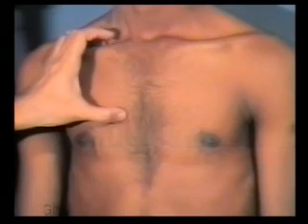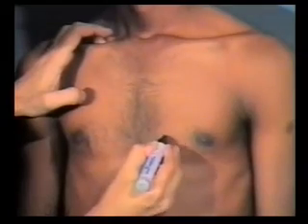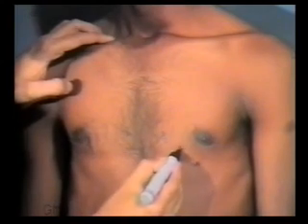The points are marked as follows. Palpate the sternal angle. The space just below the sternal angle is the second intercostal space. Mark the fourth intercostal space at right sternal border as V1. Then mark at the same level, that is in the fourth intercostal space at the left sternal border as V2. Mark V4 in the mid-clavicular line in fifth intercostal space. The point midway between V2 and V4 is V3.